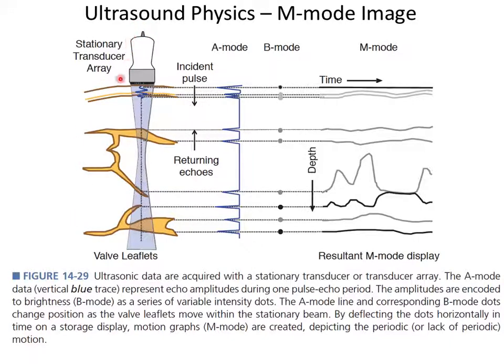So here's the transducer. Electronics connected, and the signal's going back this way, signal for transmits coming in. We make one of these little pings, and it goes down through the patient. This is the patient's chest wall. This is a depiction of the patient's aorta.